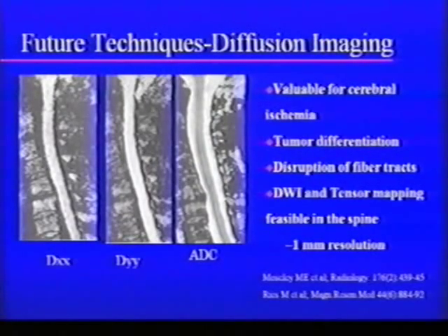These letters just refer to the direction, okay? And what you may appreciate, or at least observe, is that the brightness here is different than the brightness here, okay? The reason is because what I'm actually measuring is how easily water molecules can move, okay?